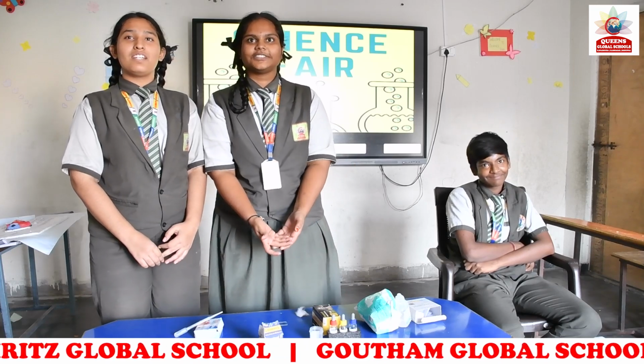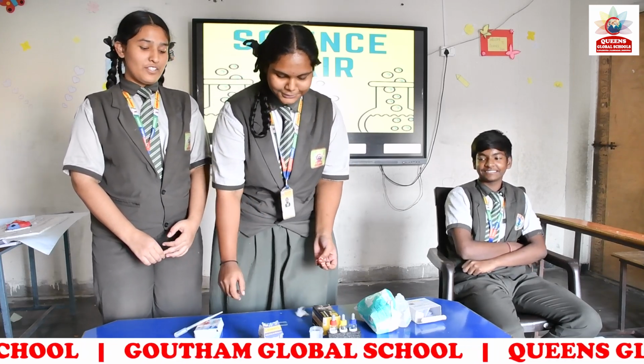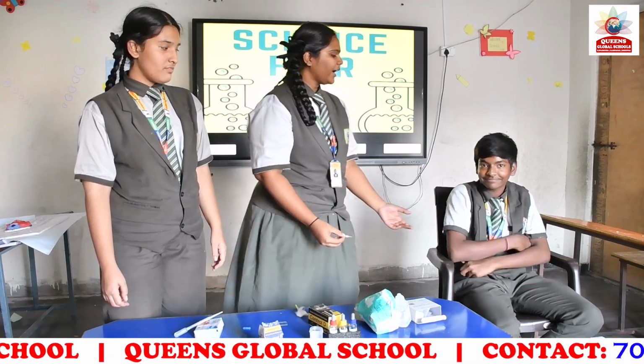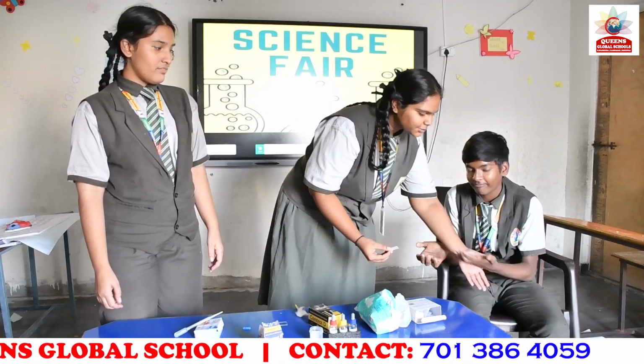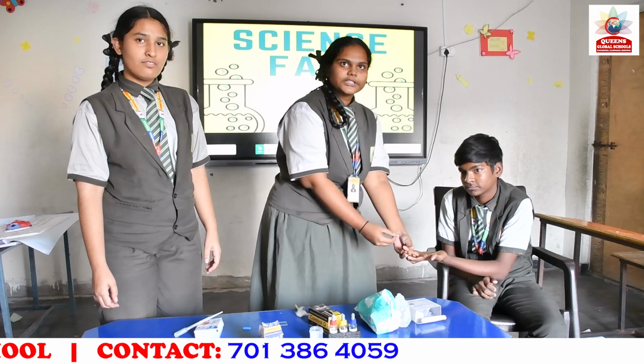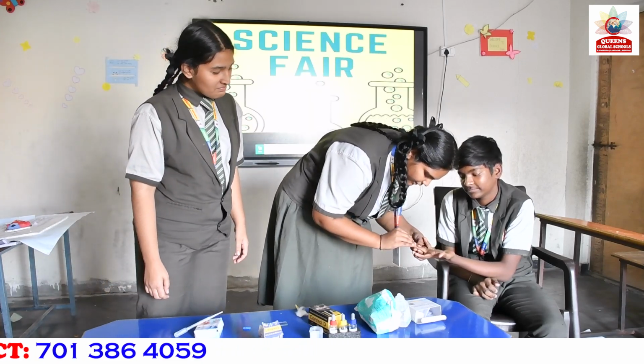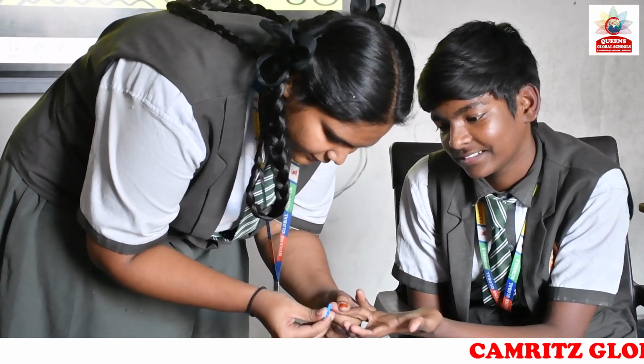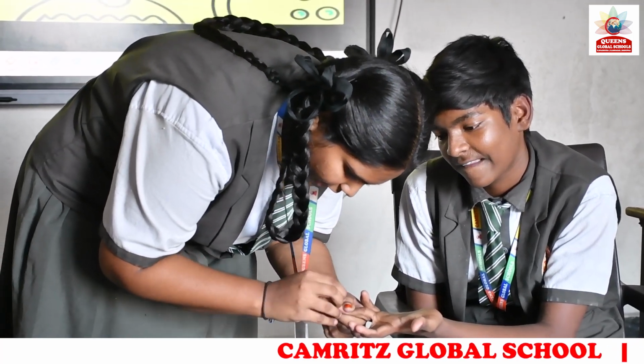Today our project is identification of blood group. First we have to take one alcohol swab and choose the third or fourth finger of the left hand and clean it with the swab. Apply some pressure and prick with the lancet rapidly.